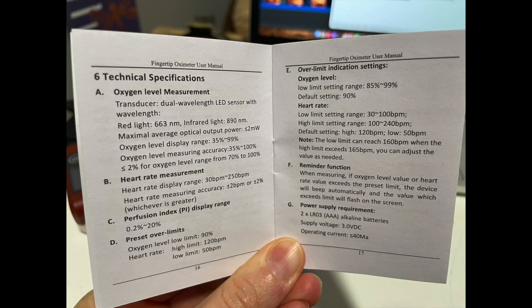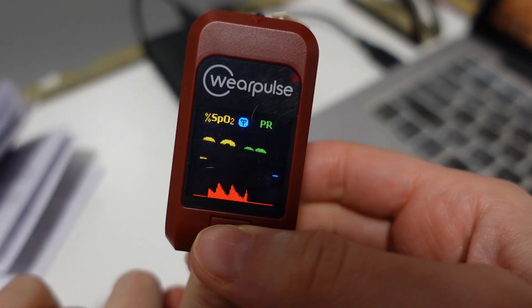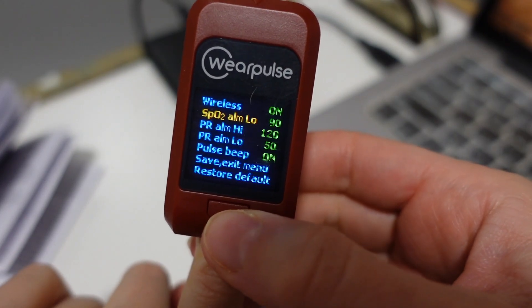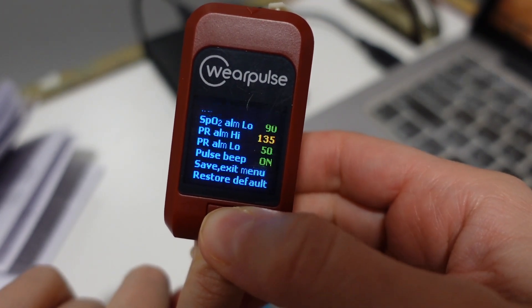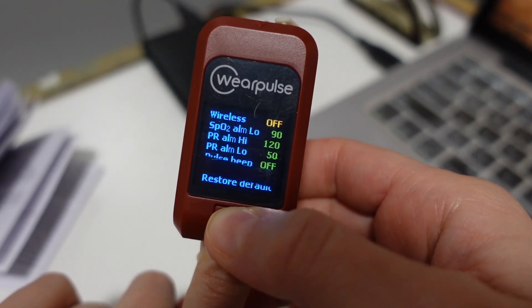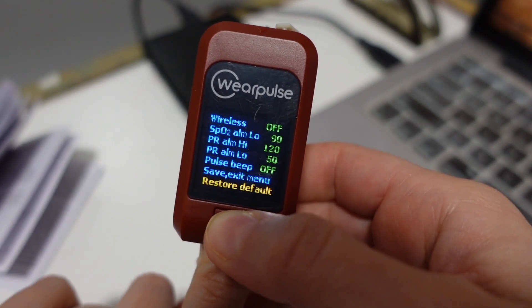One more thing — this device comes with a set limit for your heart rate and oxygen level, but you can adjust these levels on the device itself by clicking this button. And if you don't wish to connect it to the app, you can just select off where it says wireless.